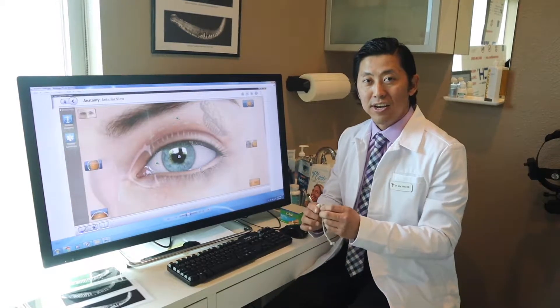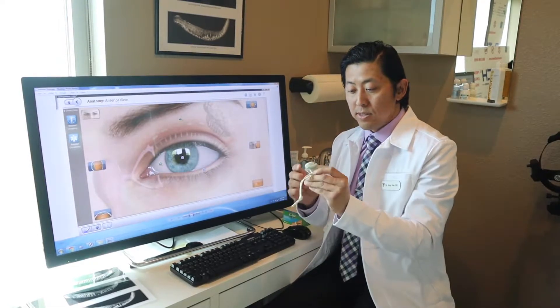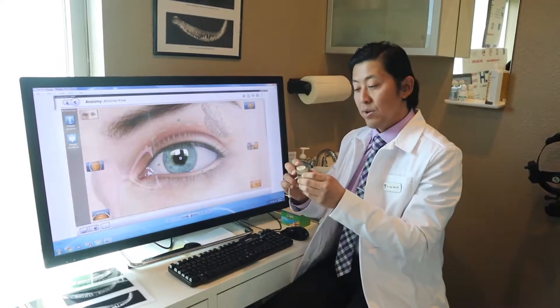Hi, how's it going? It's Dr. Han here with Healthy Eyes Optometry. I'm just going to show you what this device is and where it actually goes on the eye when it's at the office.